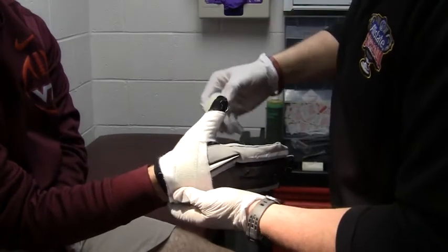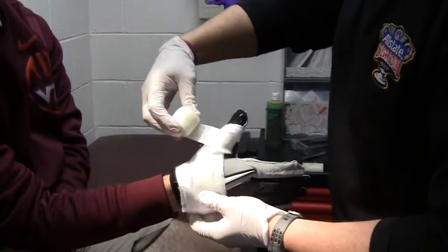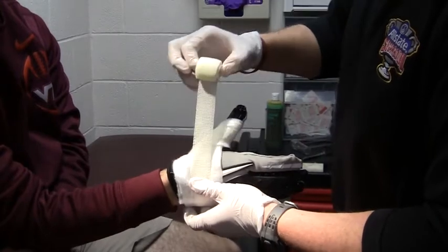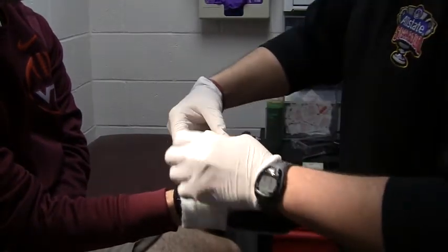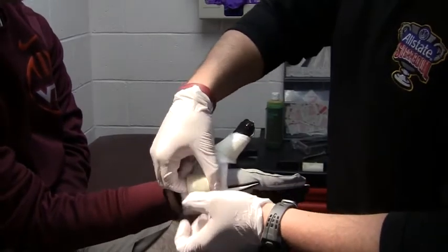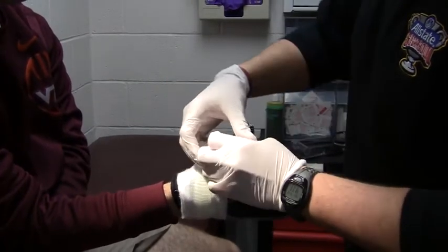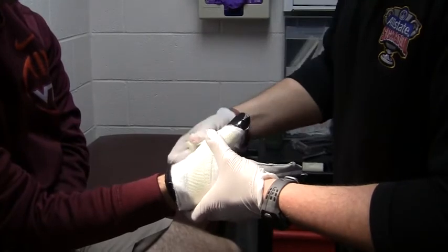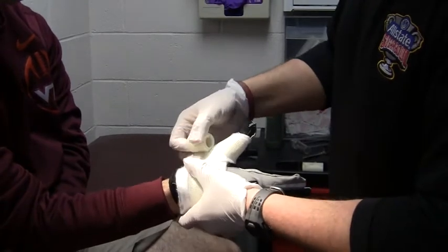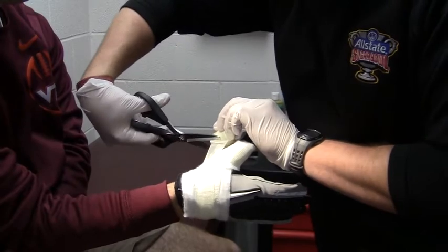Unroll the casting material in the same pattern, making 1 small loop around the thumb and 1 bigger loop around the wrist. Once you've made 3 or 4 layers around the thumb, use your scissors to cut off any excess casting material.